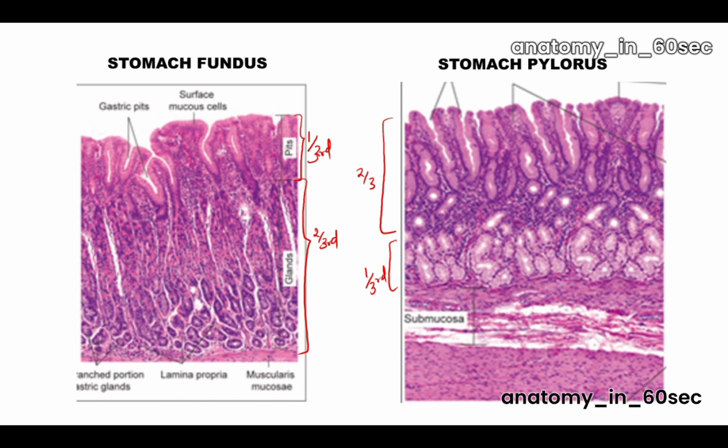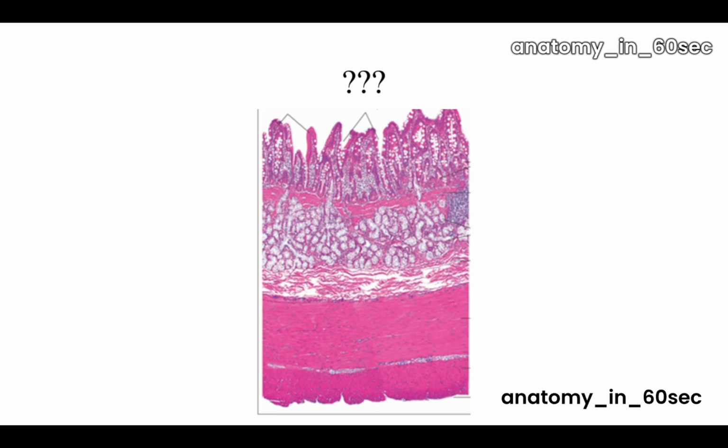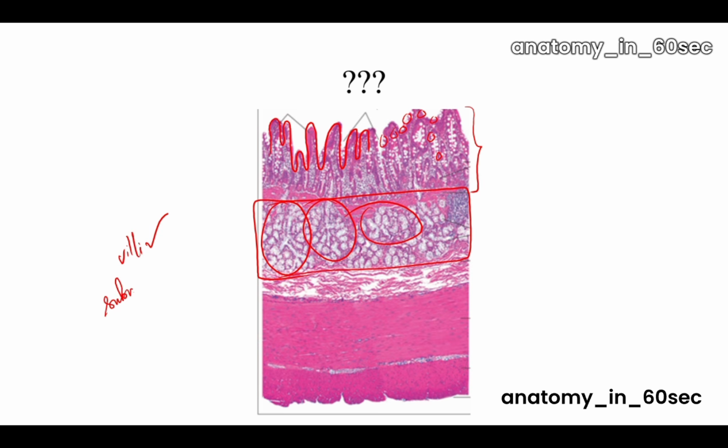Next slide, try to identify this. So in the slide you can see there are many finger-like projections. So the finger-like projections are actually the villi, and on the villi layum you can see there are some goblet cells present. Yes, goblet cells are seen. This is the epithelium, but main inge nama focus panna vendiyadhu enna this area. In the submucosa there are some glands seen. So villi is present and submucosaல glands is also seen.